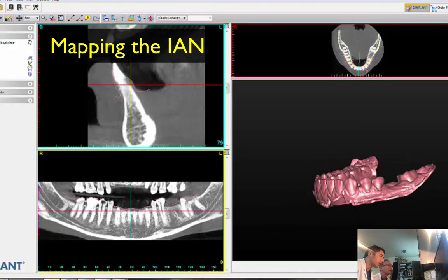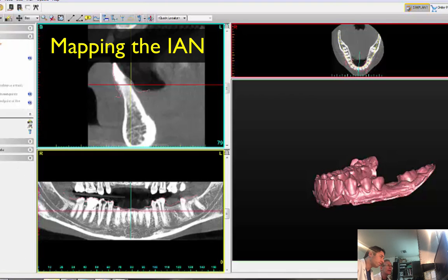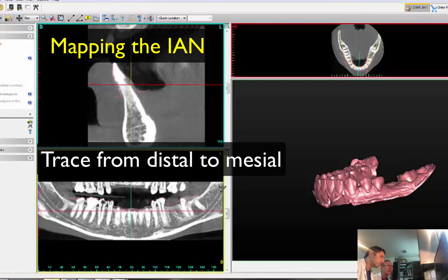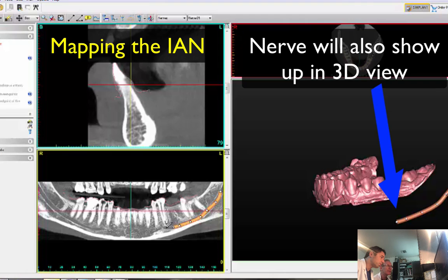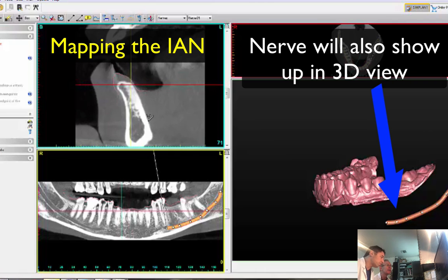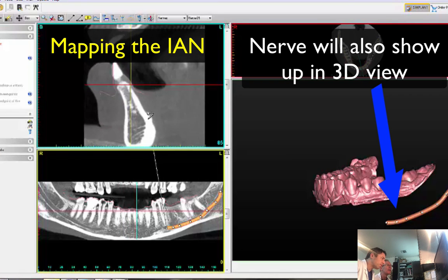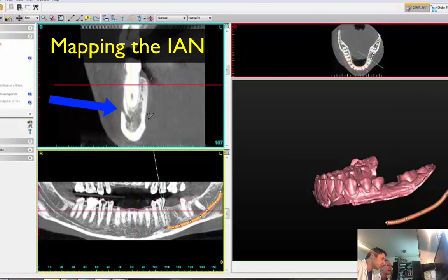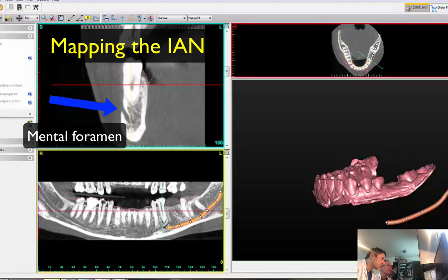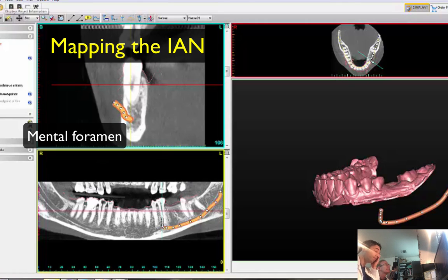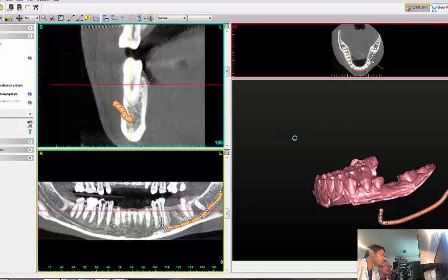Click on the nerve. Now obviously we just need the left nerve — it's obvious here. We just trace it. And just for fun, let's go through the cross-section and look at where the foramen is. I'm going to move the cross-section to roughly where the foramen is, which is here, so I know I can continue. Then what I like to do is pass it through the foramen. That's it — it's mapped. Important to save.